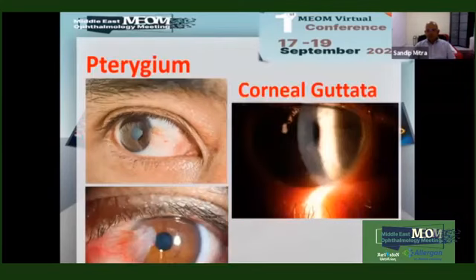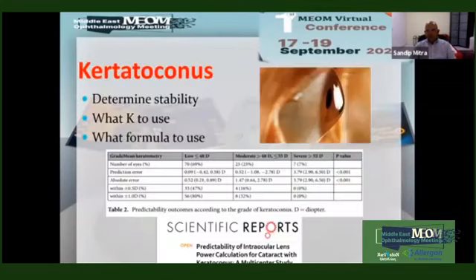So if it is an older patient, more than 40, and his cornea is stable, then the approach should be to regularize the corneal surface first. Either you can use, again, the topo-guided PRK if you have enough corneal thickness, or you put a ring, and then you can approach cataract surgery and put a toric IOL. But to approach with a toric IOL in an irregular cornea is absolutely not going to help, because the vision is not going to improve.